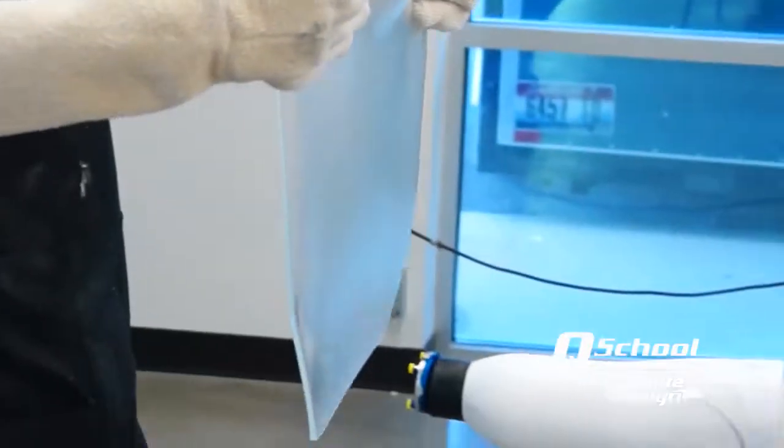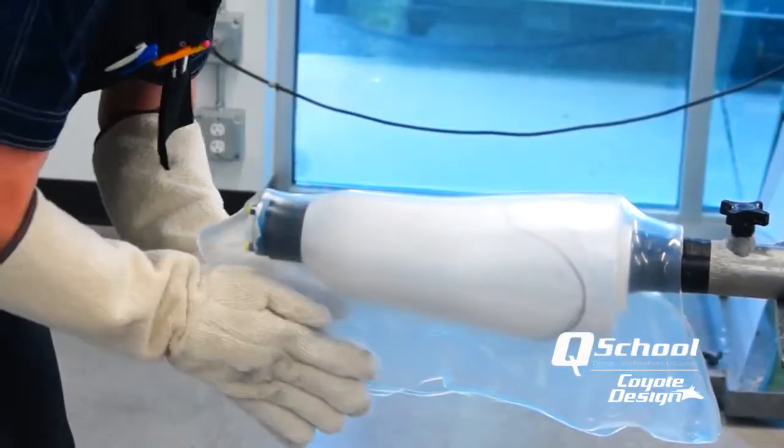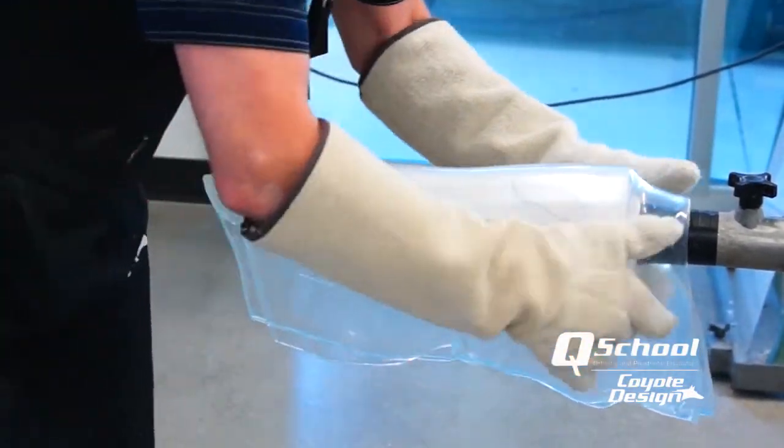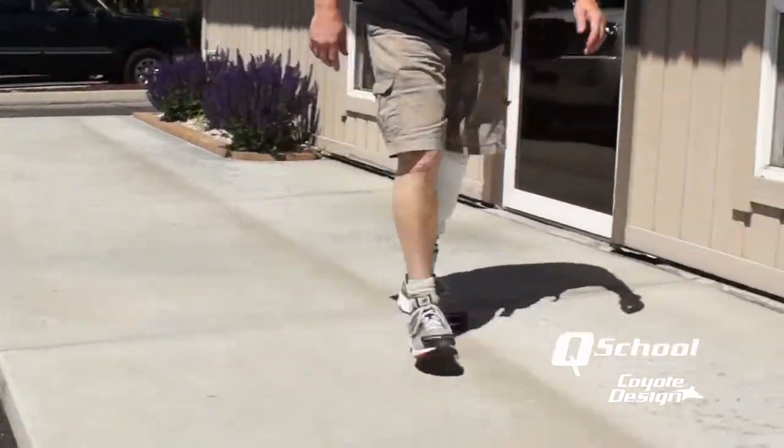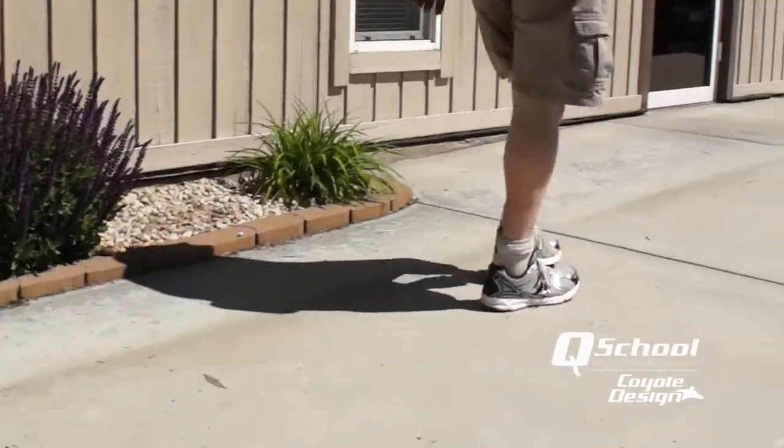The first benefit was eliminating that itch and irritation. We had also been making copoly test sockets for a number of years that turned out to be slightly more flexible than we realized — patients began stating that they preferred the fit of the test socket to the definitive socket. That's when we realized we needed a little more flexible material in our laminations, and this happened to coincide with our discovery of basalt.